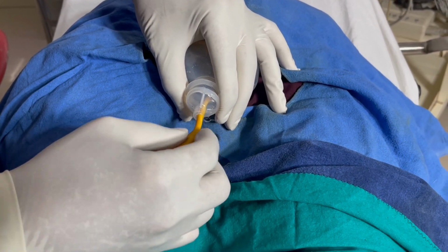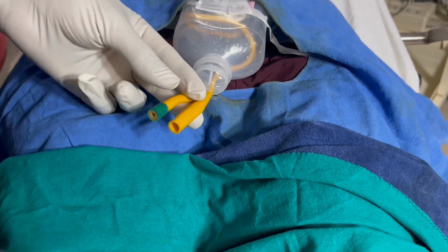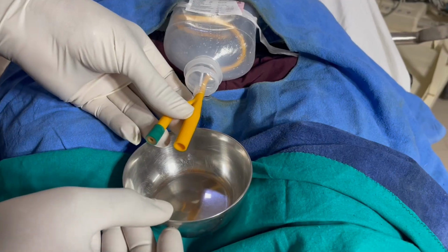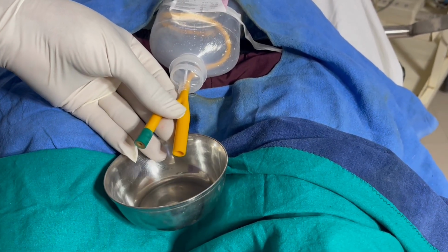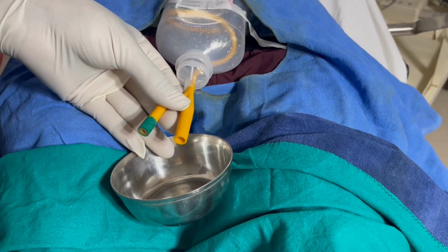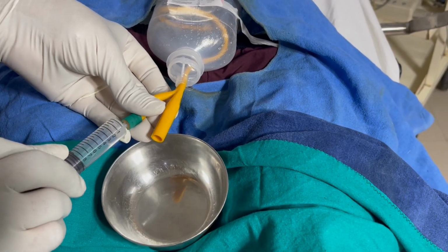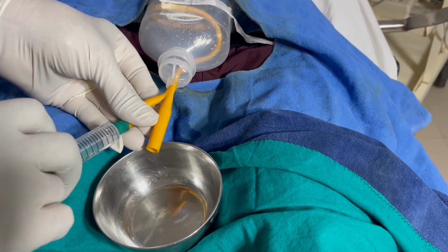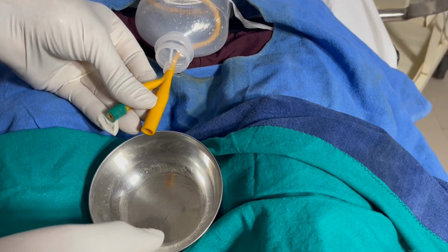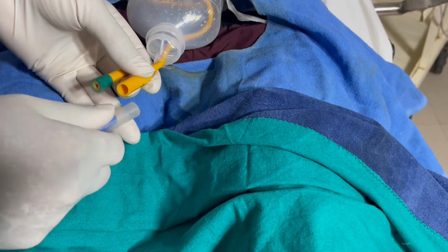So once the complete catheter is passed inside, I will see that the urine is coming out. Once the urine is coming out, I will inflate this bulb with the saline, around 10 cc. Once I inflate it, I will connect the catheter with the urobag.